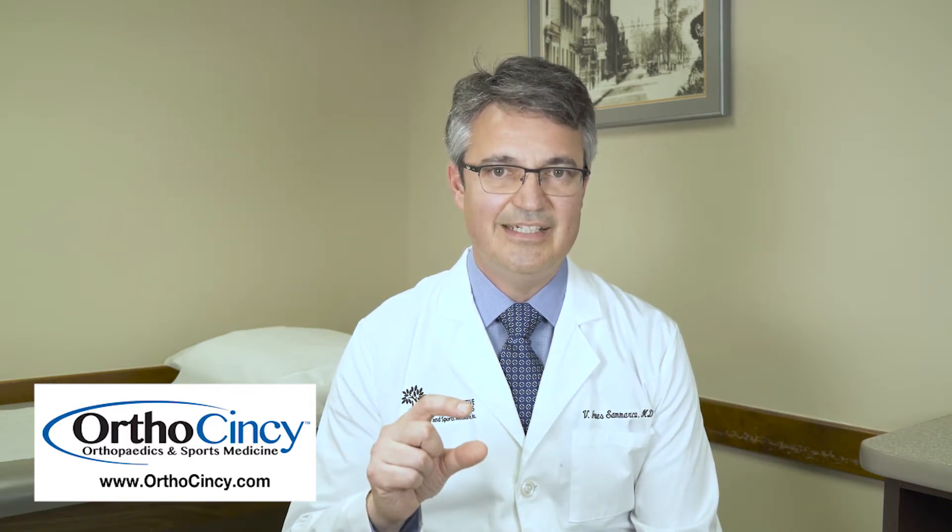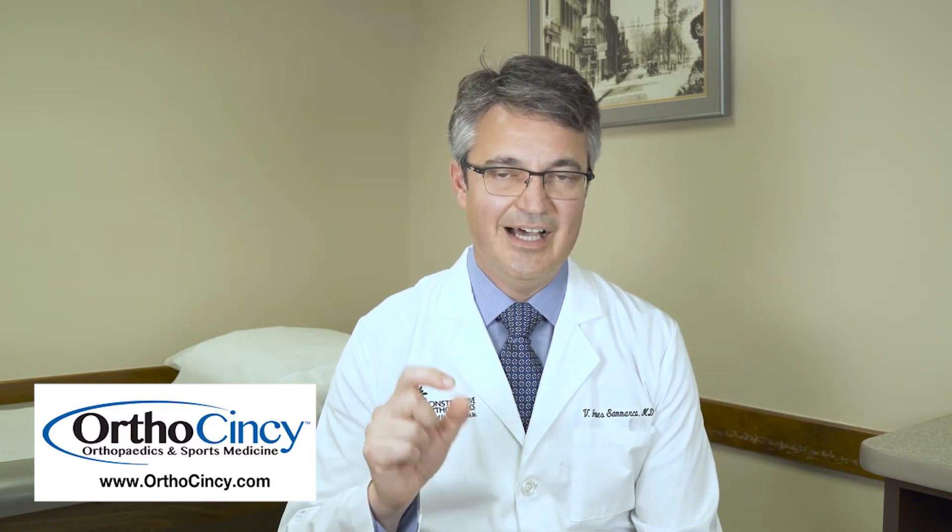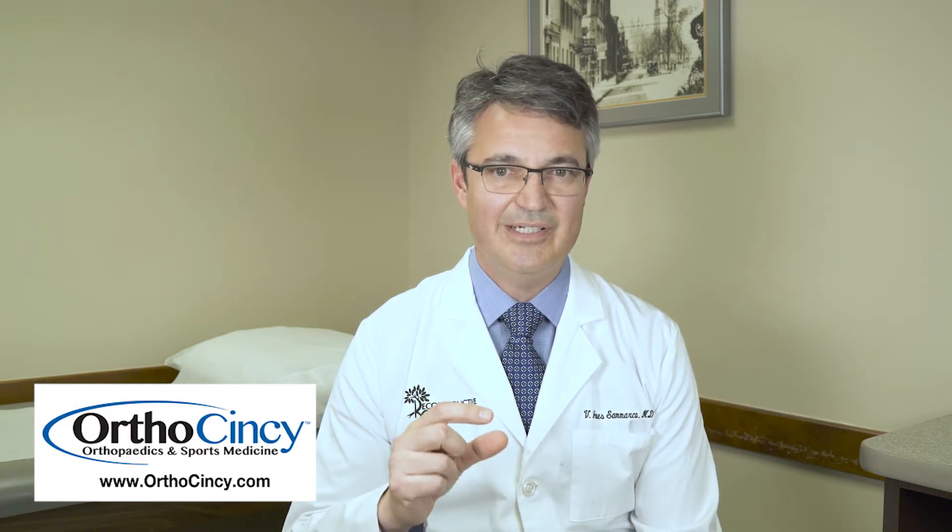The other area where ultrasound can be very helpful, particularly in my practice, is to guide injections. No one wants to come to the orthopedic surgeon's office and hear they're going to get an injection. One of the advantages of the ultrasound machine is that we can see exactly where we want the tip of that needle to go, and whether there's anything between the skin and our target that might cause pain if we were to bump into it inadvertently.